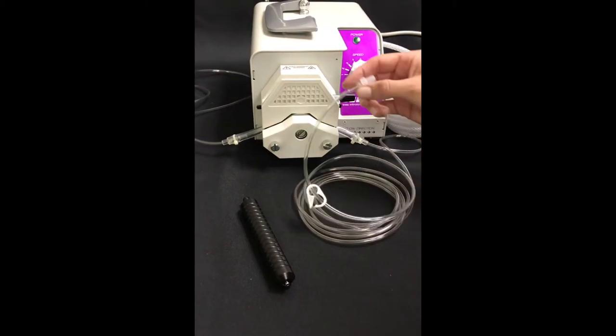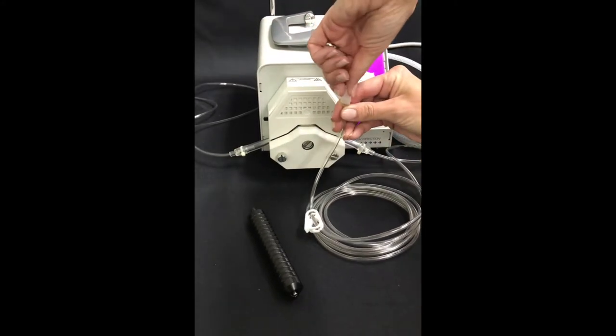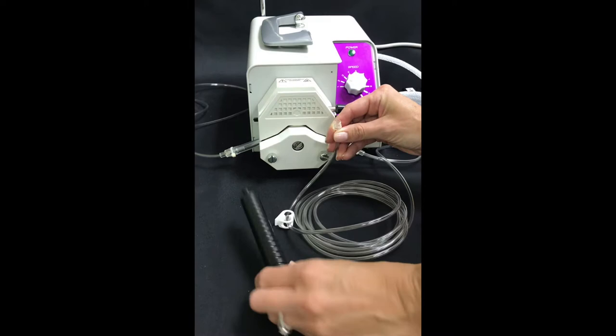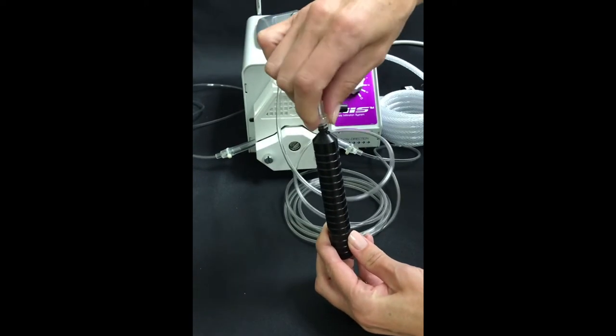Using sterile infusion tubing, the infusion handles connect to the infusion tubing with the lure lock. The infusion handle can be gassed, autoclaved, or soaked.